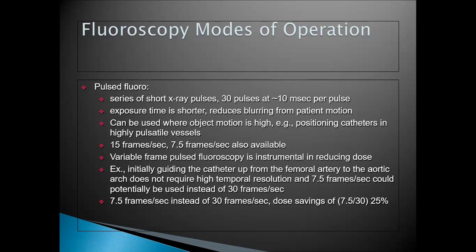So, for example, if one wants to introduce a stent into a vessel that is blocked, you want to use a stent to open it up. Of course, a catheter has got to be put in place before introducing whatever I want to introduce. So in that case, pulse fluoro should be used if it's available. Of course, it should be available.